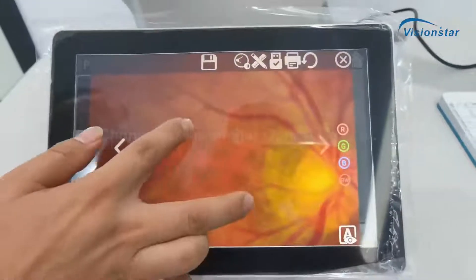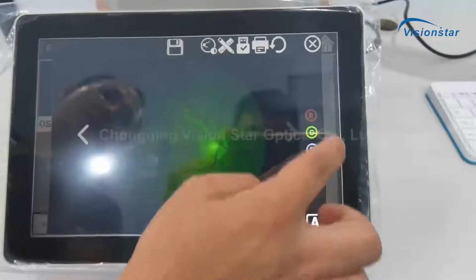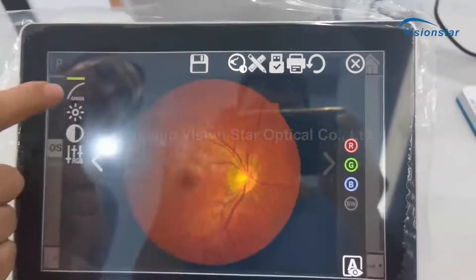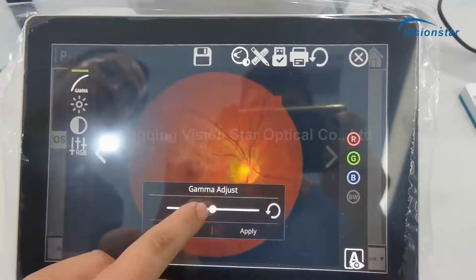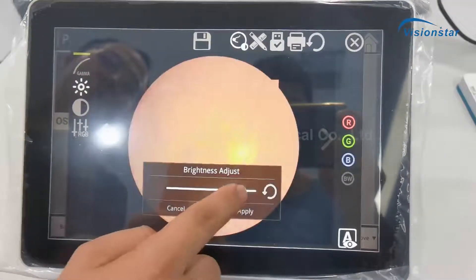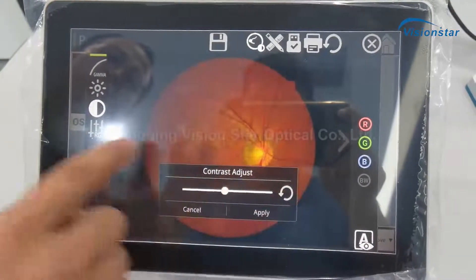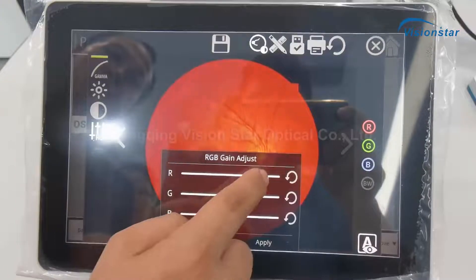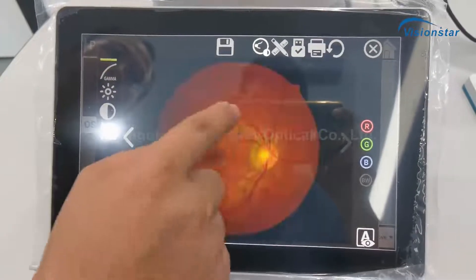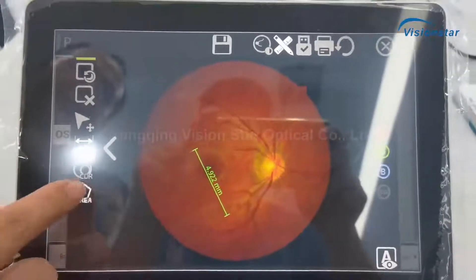You can enlarge the image on the monitor. There are some functions: you can change the color — red, green, blue. You can also adjust gamma, brightness, and contrast. You can see the image in different colors.